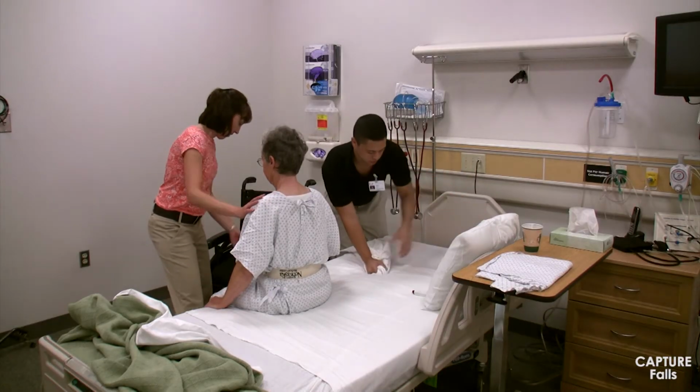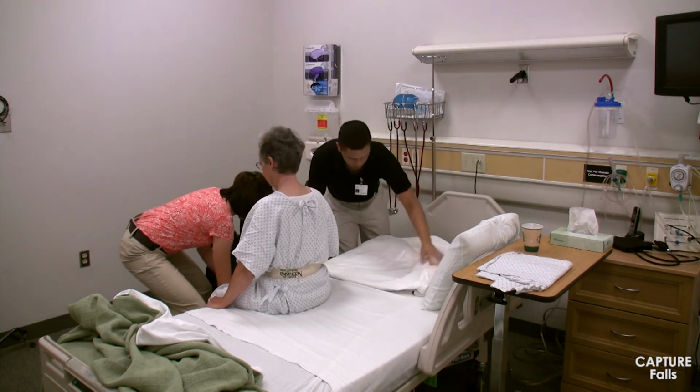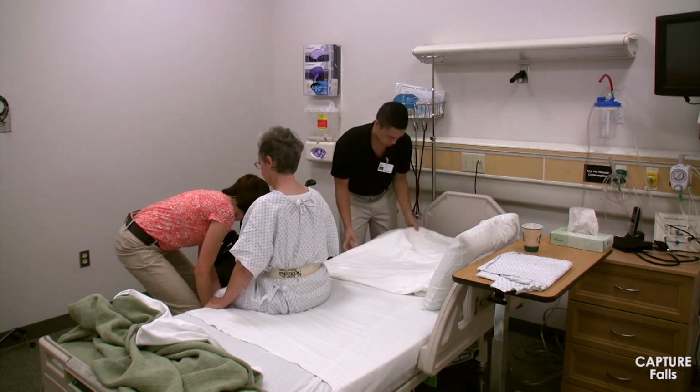The second person is assisting from behind by directing the patient's pelvis laterally during the transfer. He should place one foot in the space between the bed and the wheelchair. With the other leg, he should kneel on the patient's bed after first placing clean linen there for infection control.